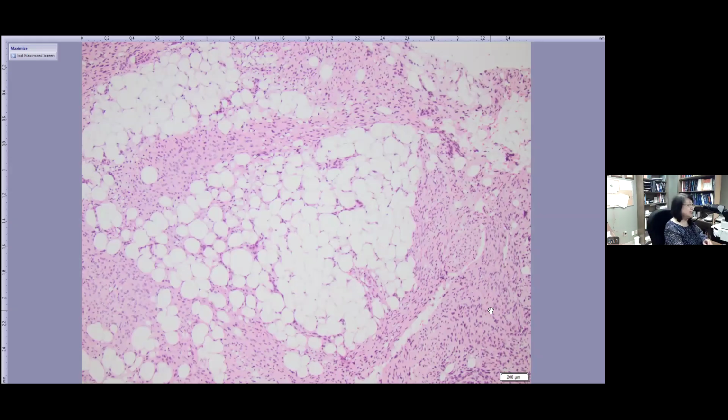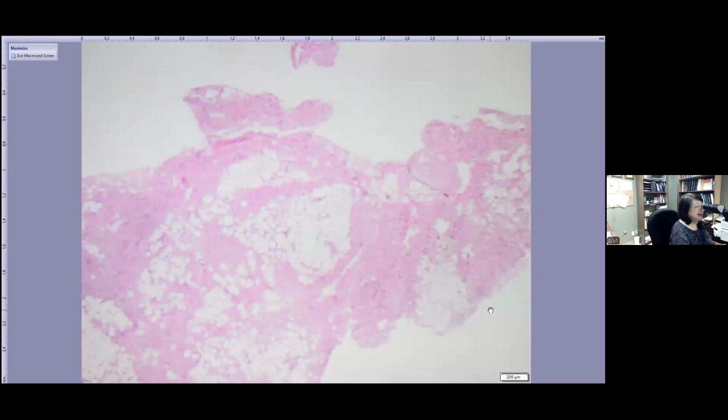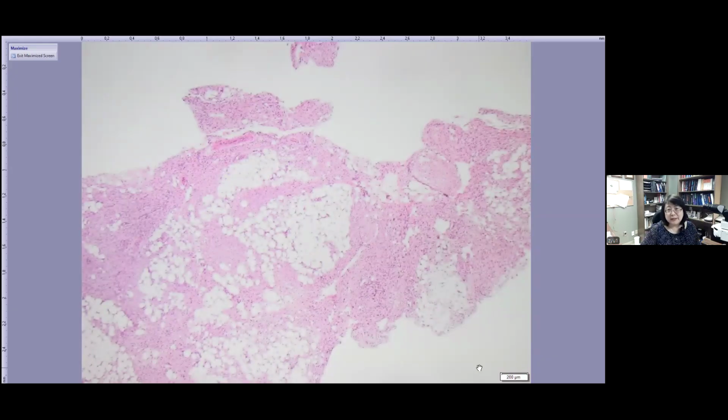So any question on this one? Lipofibromatosis. It's also a WHO recognized diagnosis. The recurrence rate is high. And right now, there are some gene tests. Before, we usually didn't do genes. Now with NGS, they identify so many genes. This one seems associated with FN1 mutation with some partner genes.